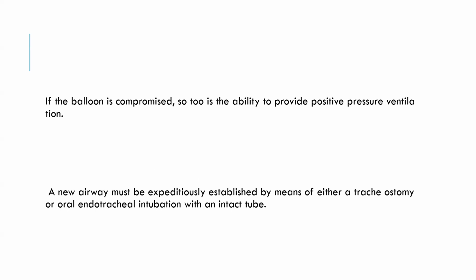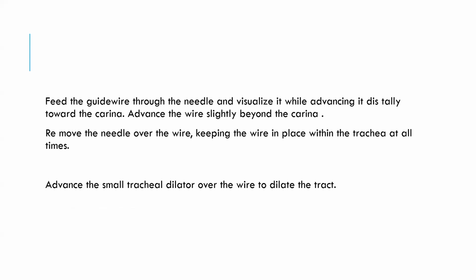Feed the guide wire through the needle and visualize it while advancing it distally towards the carina. Advance the wire slightly beyond the carina. Remove the needle over the wire, keeping the wire in place within the trachea at all times.